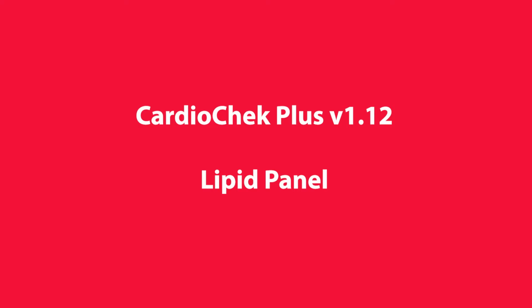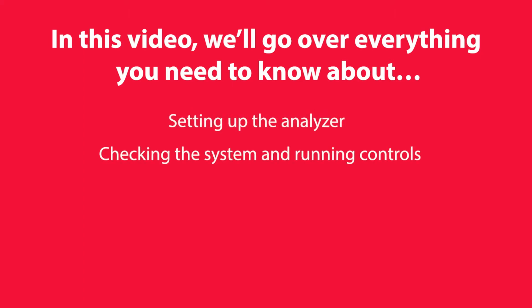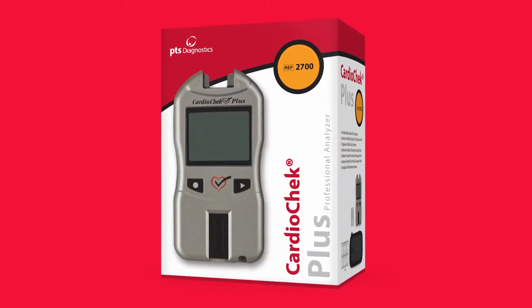In this video, we'll go over everything you need to know about setting up the analyzer, checking the system and running controls, running a test, cleaning and disinfecting the analyzer, and storing and handling the analyzer. Today, we will be showing you how to run a PTS panel's lipid panel reflectance test.